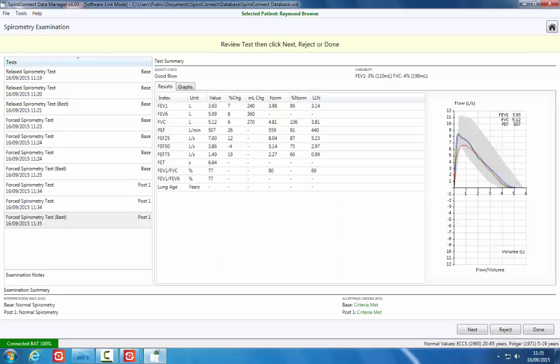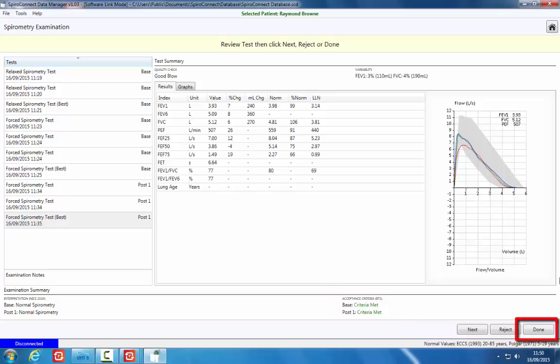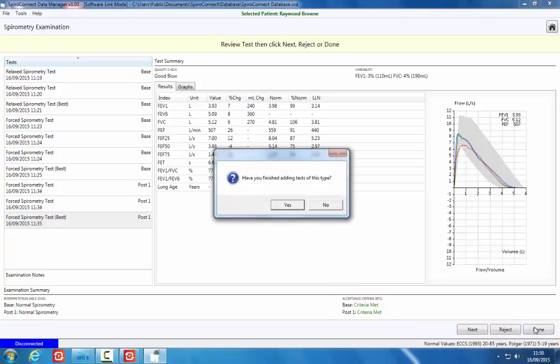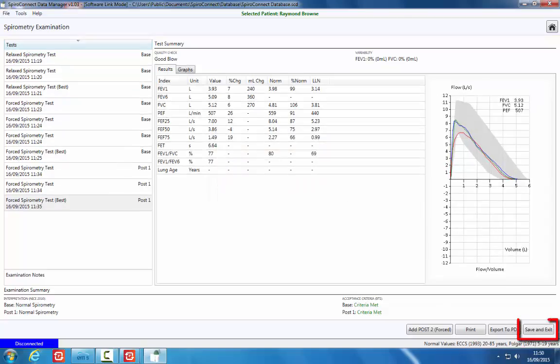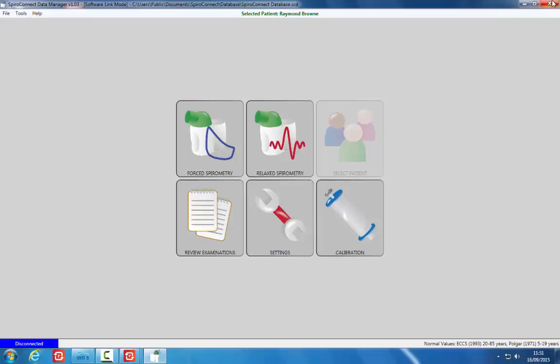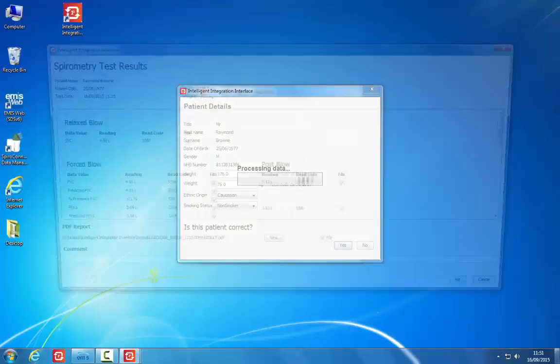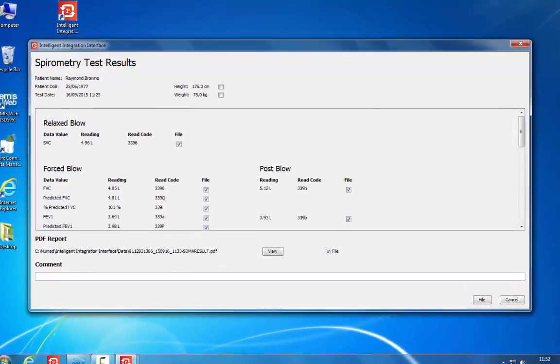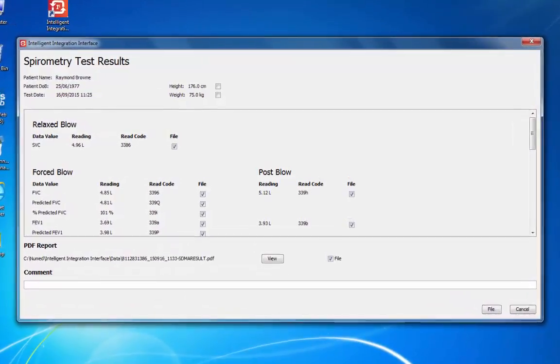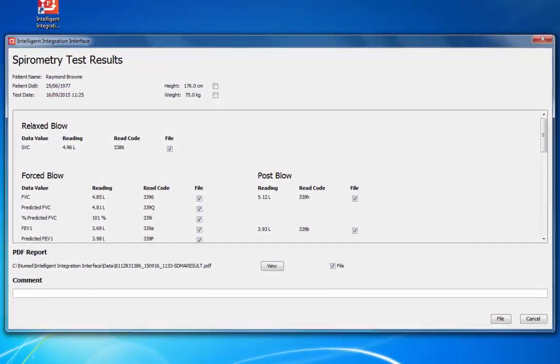When sufficient blows have been completed, click the Done button. Save and exit the examination and exit the software. The i3 software will then present the data values available for filing to the patient record in the clinical system.